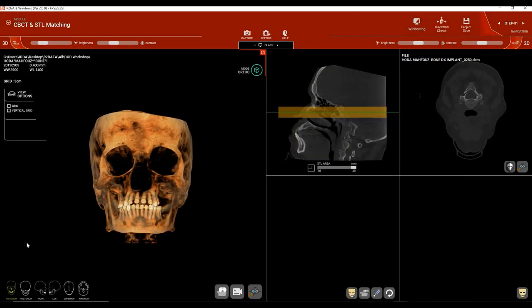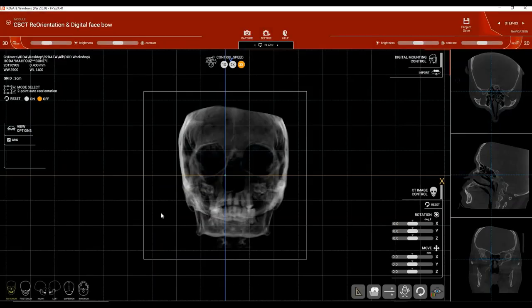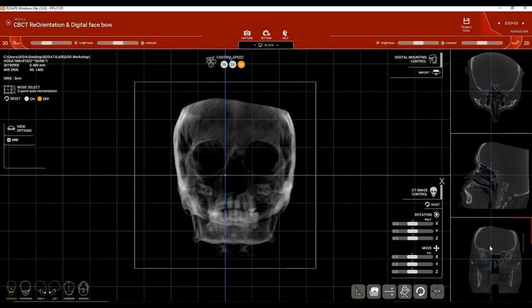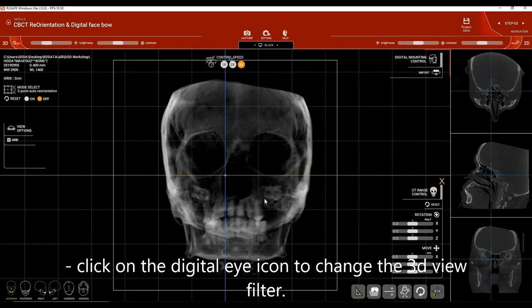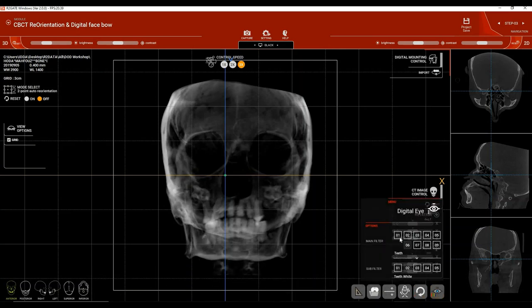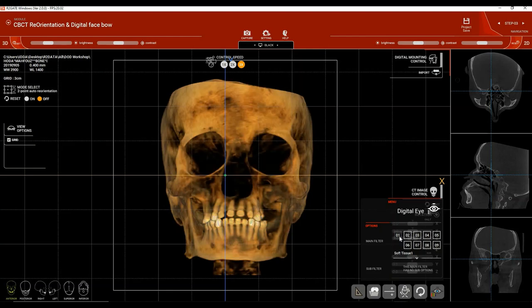To reorient the CBCT scan, go to step number 3 in the Digital Oral Design R2-Gate software. On the right side you'll find the controls for the 3D view; on the left side the 3D view; and in the middle the CT image controls for rotation and movement. To change the 3D view, click the icon on the lower right that says Digital Eye and change the filter — I personally prefer filter number 1.